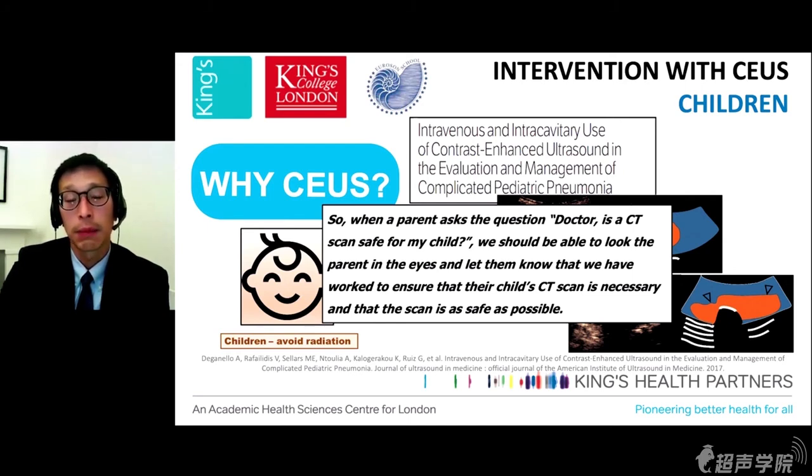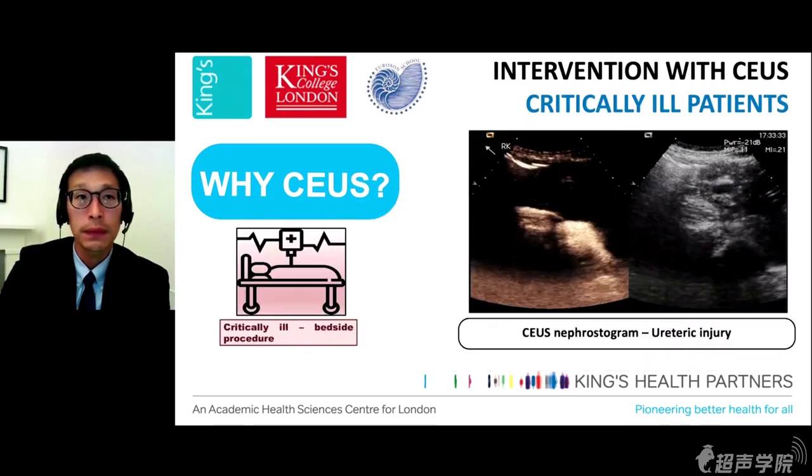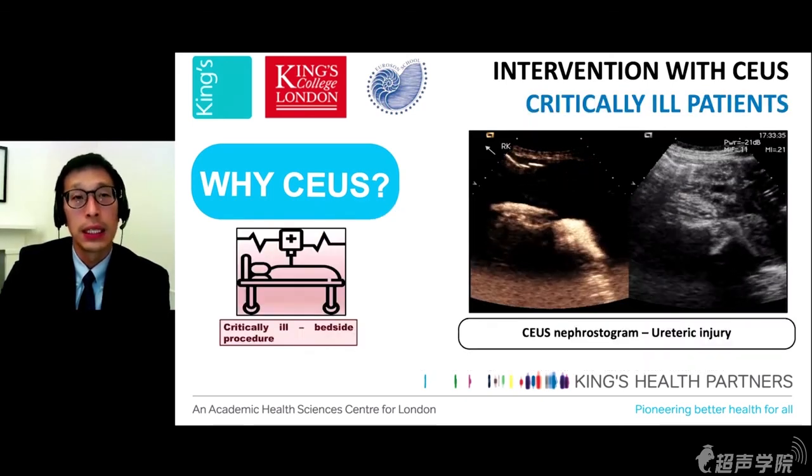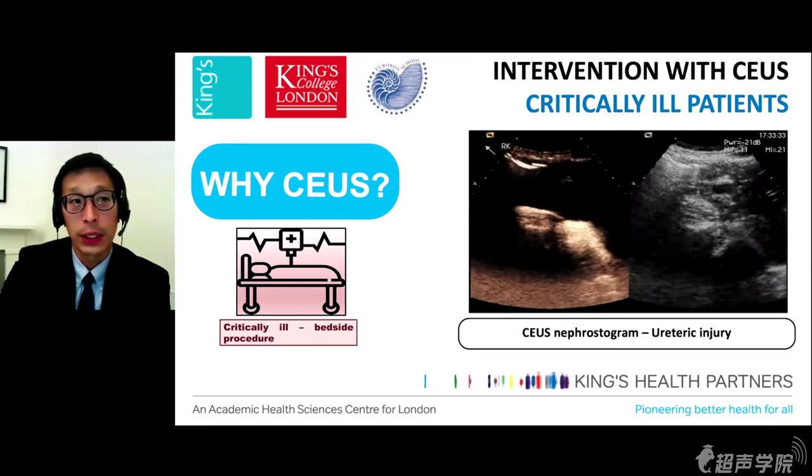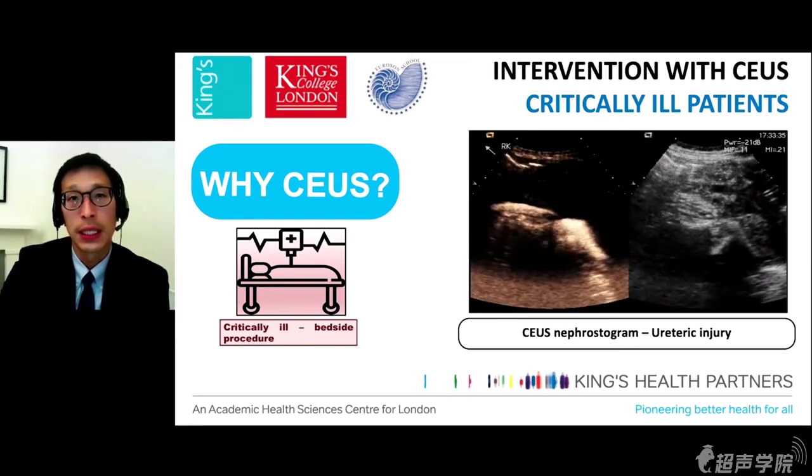We should be able to look the parents in the eye and let them know that we have worked to ensure that the patient's irradiation exposure is necessary. And one of the alternatives we should think about is whether contrast enhanced ultrasound could be used instead of a CT scan.